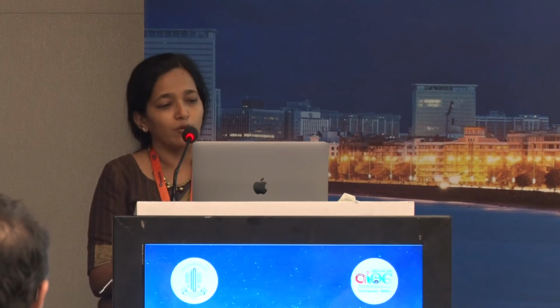Third thing is that you have to look for vitreous prolapse in these cases. If you have a vitreous prolapse, you'll have to manage it intraoperatively before you go ahead with your cataract surgery.